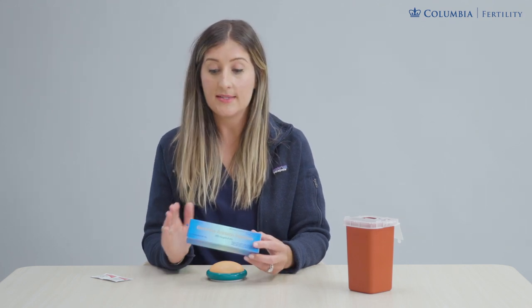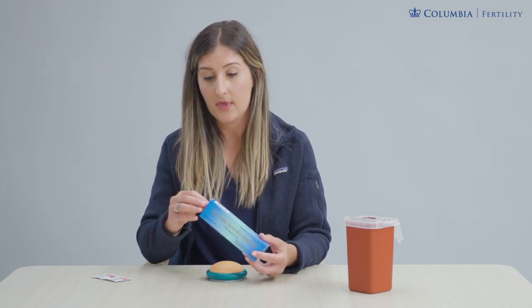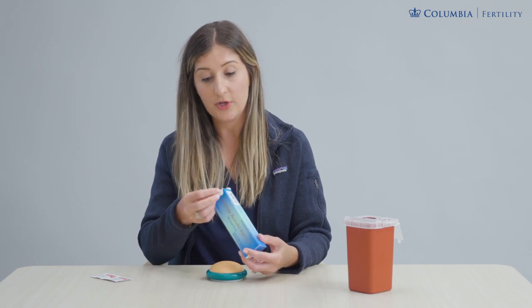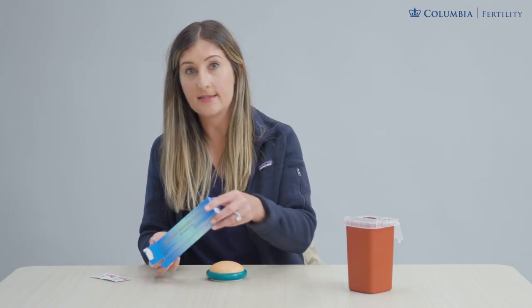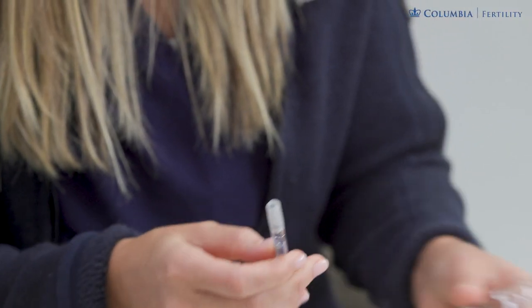Typically it's taken every evening around the same time of night once started, because it is going to prevent you from ovulating, so it's very important to keep a consistent level of this medicine at all times. Inside of this box is a pre-filled syringe of medicine and it's a standard dose — nothing you have to dial up or mix, it's just a pre-filled needle.